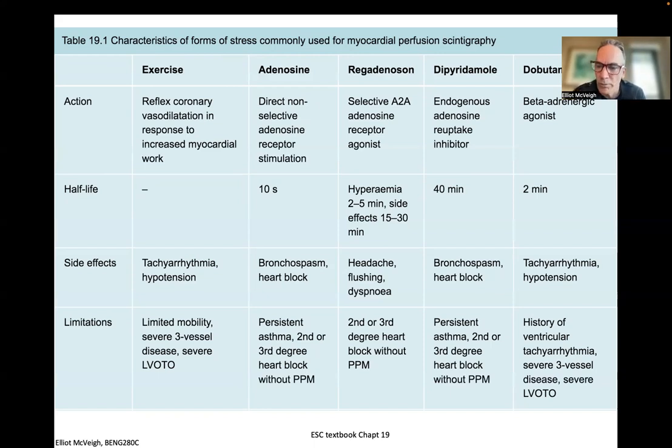And you'll put an echo probe on the patient and crank the dobutamine dose through about 4 different levels. Watch how the heart responds to those levels of stress. And if at a certain level of stress, the mechanical contraction of the heart becomes quite asymmetric or just drops out in certain places, then you call that test positive and you stop. And then that is a positive sign that there is a blood flow issue in that person's heart. So all of these are done commonly.